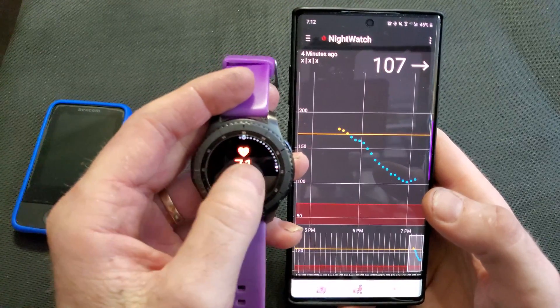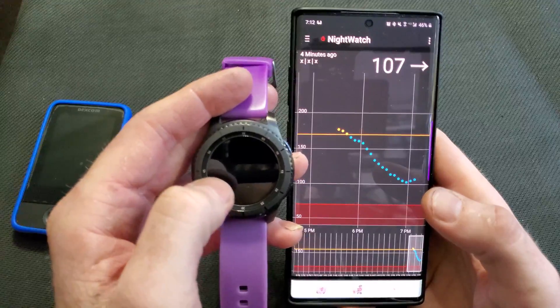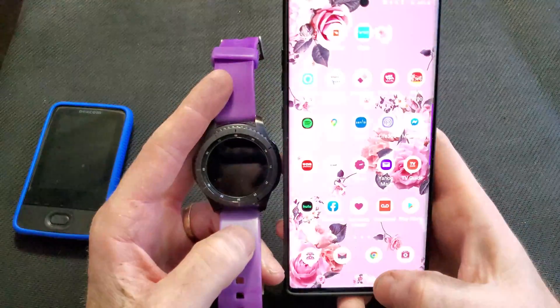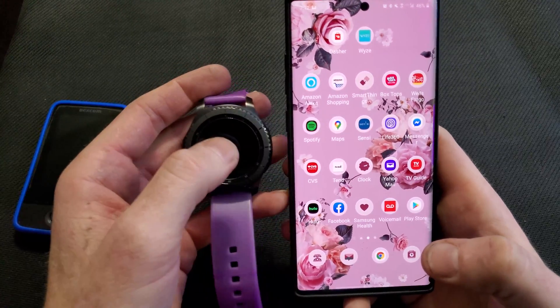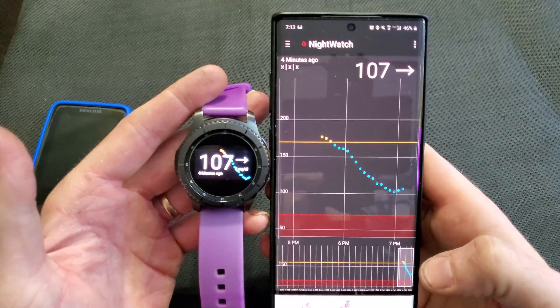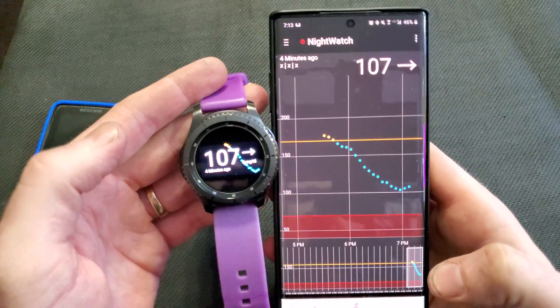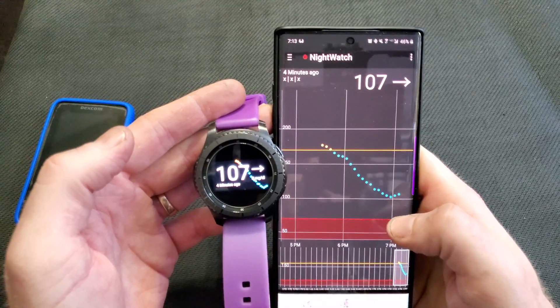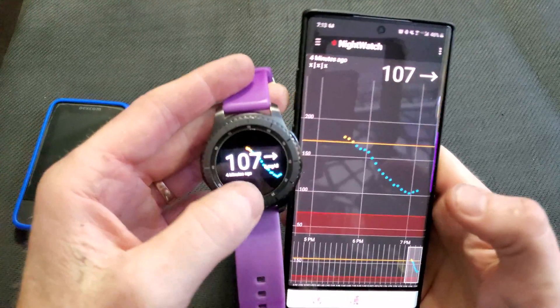There it is — it's at the very end. Sometimes it will take a second. If I double tap on it, it will pull up the app so you can see your readings. It was high a little bit earlier, so it will show all that on there.